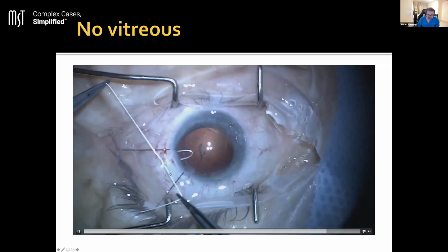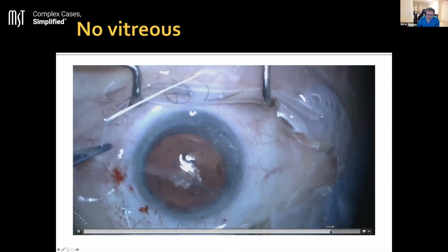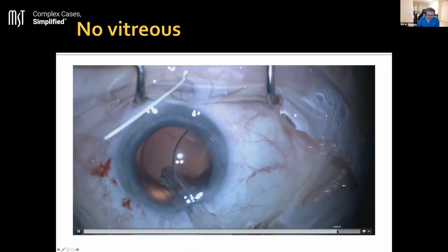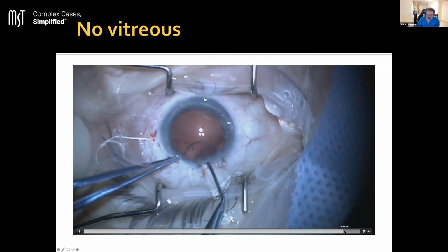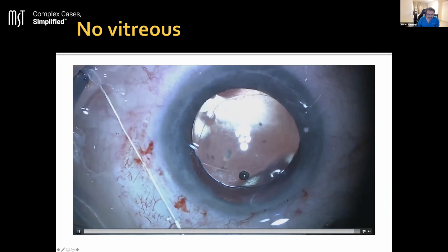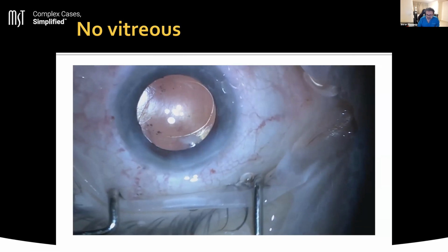We tie that off with a couple of slip knots, put a capsular tension ring in as well for circumferential support of the capsular complex, and then we place our intraocular lens into the capsular bag, and then we finally tighten this off once we're happy with the position of the lens. And this patient did very well and ended up with 6/6 vision unaided without going into the vitreous cavity.